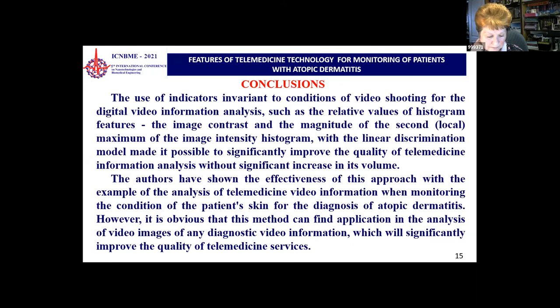Conclusions. The use of indicators invariant to conditions of video shooting for digital video information analysis, such as the relative values of histogram features, the image contrast and the magnitude of the second local maximum of the image intensity histogram, with the linear discrimination model, made it possible to significantly improve the quality of telemedicine information analysis without significant increase in its volume. The authors have shown the effectiveness of this approach with the example of the analysis of telemedicine video information when monitoring the condition of the patient's skin for the diagnosis of atopic dermatitis.